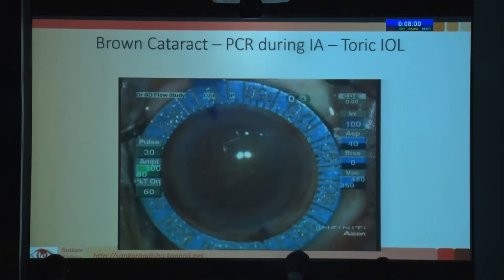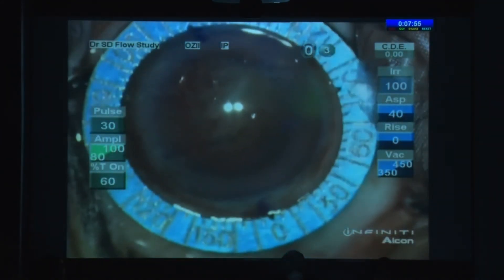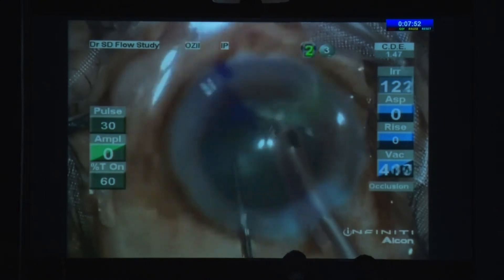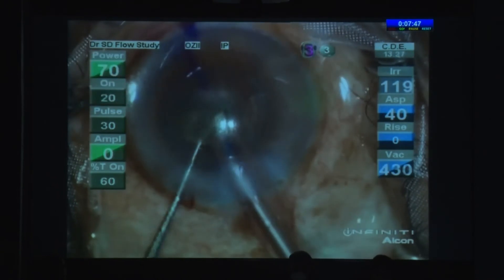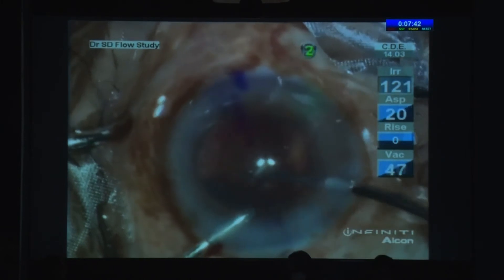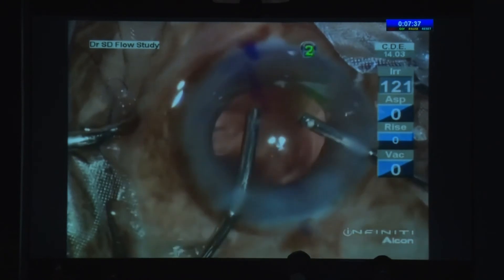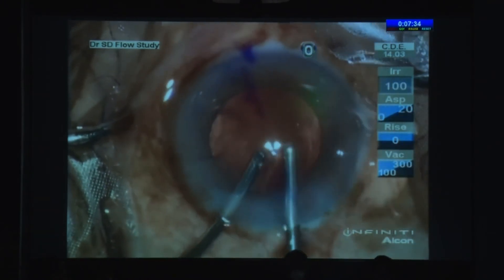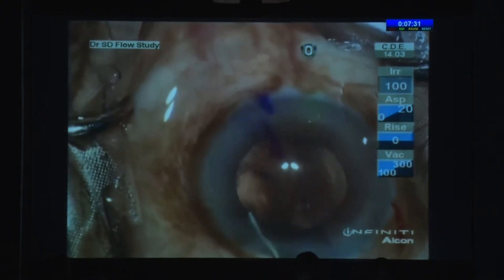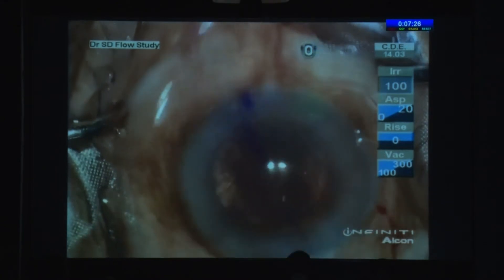This was a brown cataract case planned for a toric IOL. When you do a brown or black cataract, the problem is you relax during IA — and most PCRs happen during IA. Here I had a PCR and was actually holding the capsule with the IA tip, so I released it with the other hand. Then I injected viscoelastic and came out — this is a more dispersive viscoelastic.